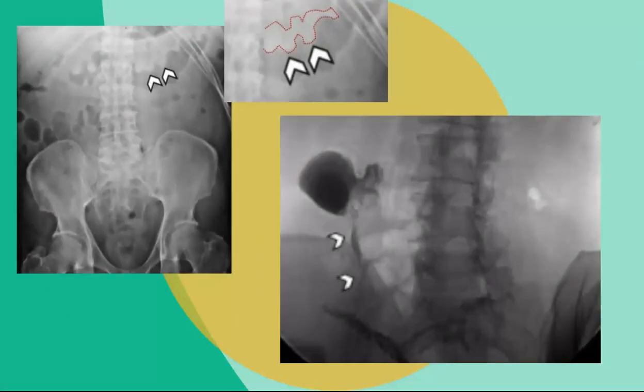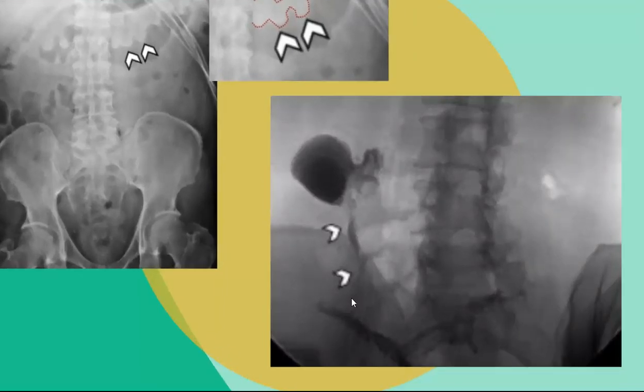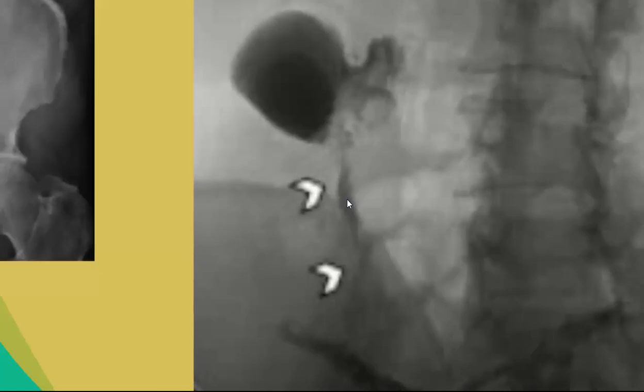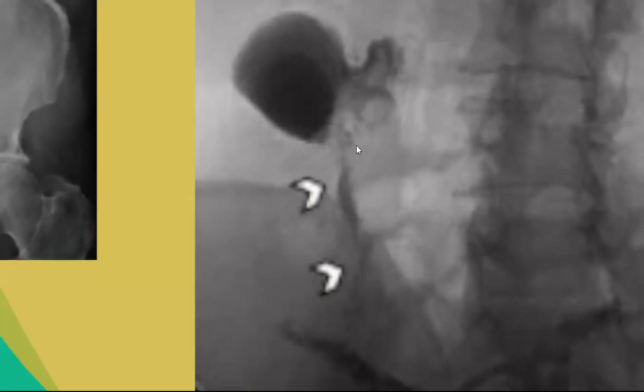Fluoroscopy has a limited role in the critically ill patient, but can be useful for evaluating fistulas and early leaks. Here, contrast was injected into a sinus opening, showing this tract communicating with the bowel, confirming the fistula.